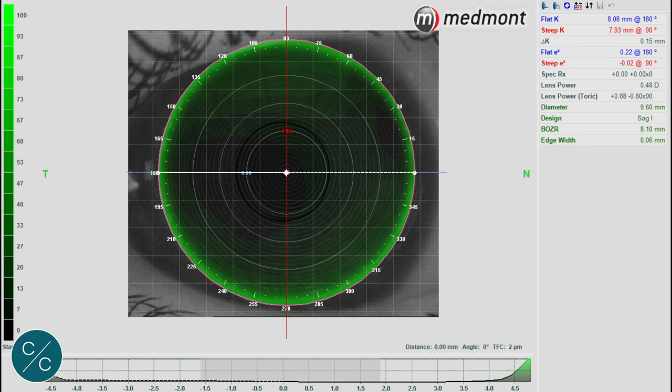This is the Medmont image of the suggested first lens. If you look at the top right hand corner of the screen, you can see that the flattest K lies along 180 and measures 8.08 mm, and the steepest K lies along 90 at 7.93. That means we're dealing with a very small amount of corneal astigmatism — probably the most difficult to fit with a spherical lens. It's suggesting that we should start with an 8.10, so let's see what happens when we put that lens on the eye.